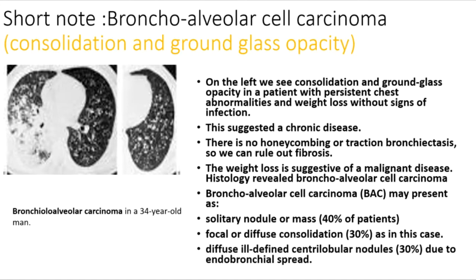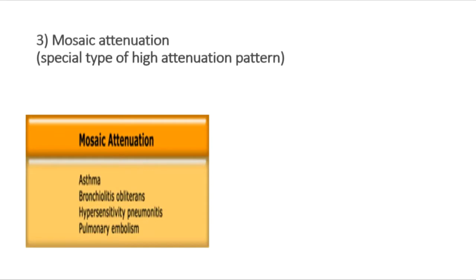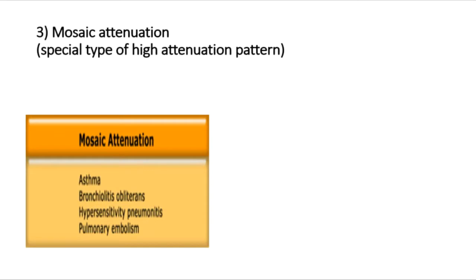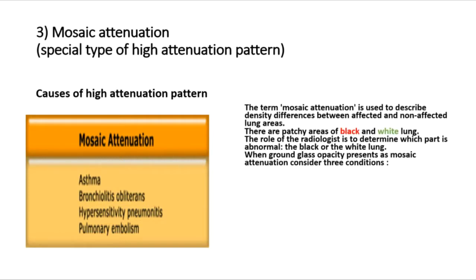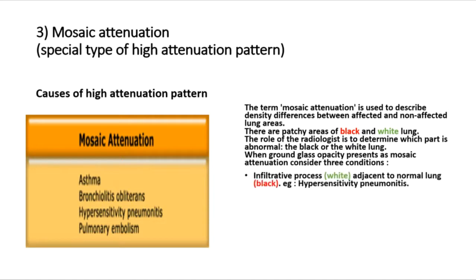Mosaic attenuation is a special type of high attenuation pattern, used to describe density differences between affected and non-affected lung areas — patchy areas of black and white lung. The radiologist's role is to determine which part is abnormal: the black or the white lung. When ground glass opacity presents as mosaic attenuation, three conditions should be considered: an infiltrative process (white lung adjacent to normal black lung), e.g., hypersensitivity pneumonitis.